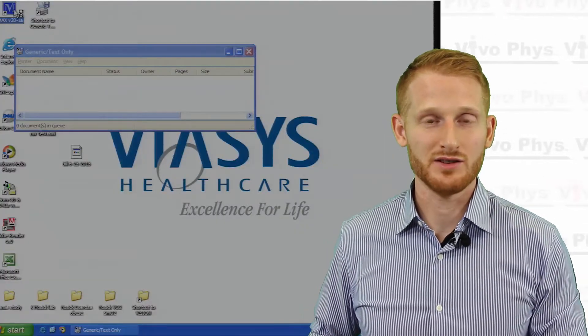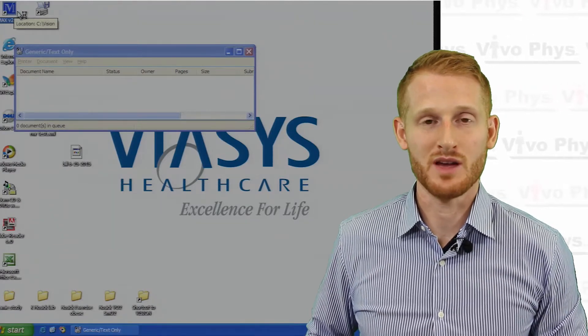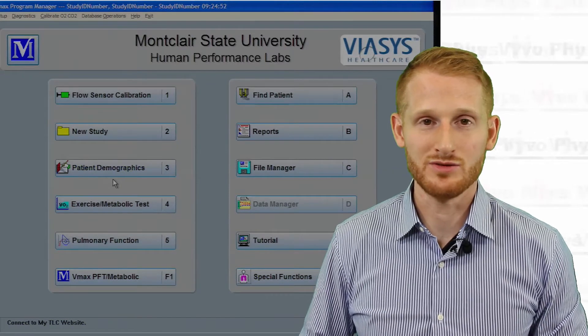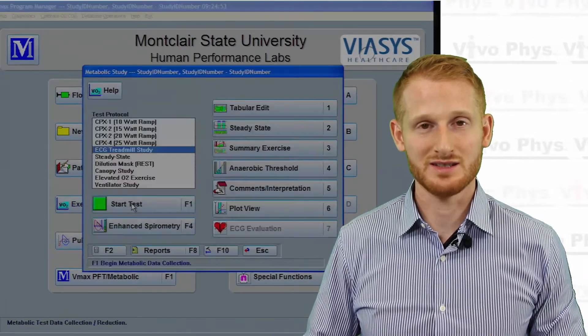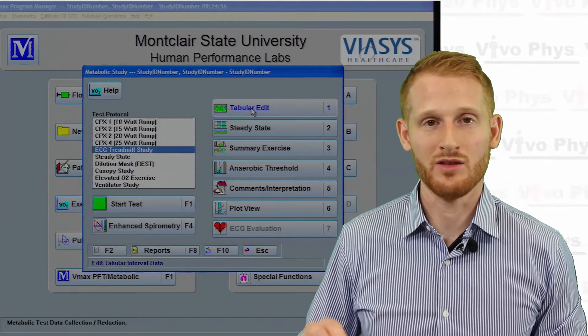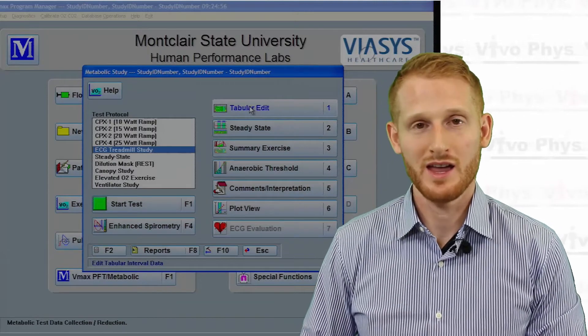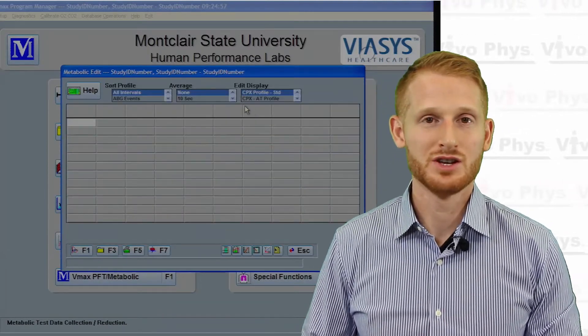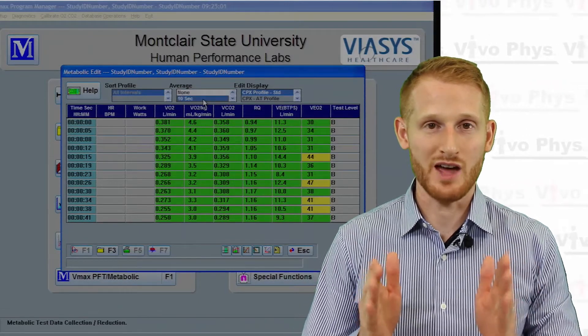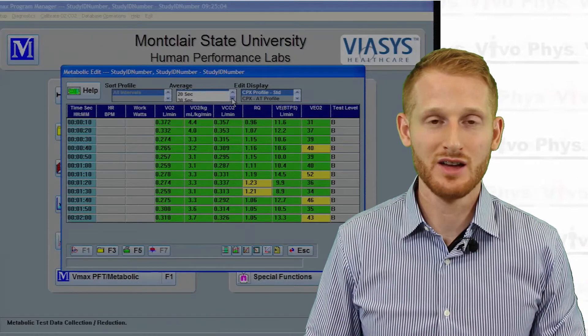Once the text file is chosen as the default printer, go back into the metabolic cart software, go back into the exercise and metabolic tests button within that software, and click on the button that says tabular data or tabular edit. Within that, you can then change whatever the default is for how much time to average per line in your text file.